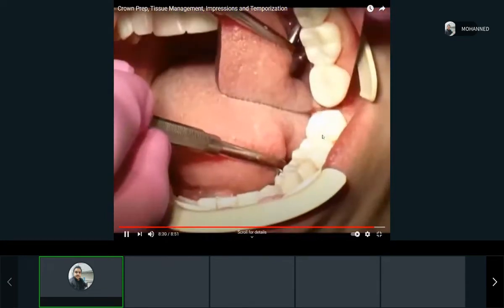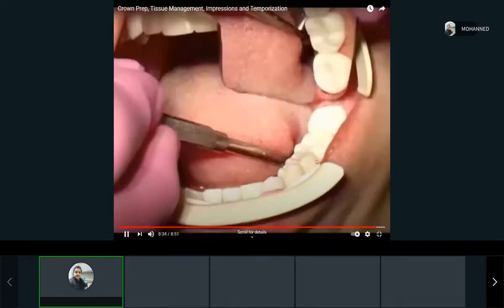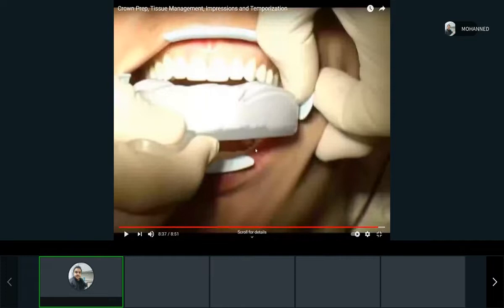It's not worth it to make separate ones because they'll break. It's better to have them that way. Yeah, definitely. Because it's not a bridge, it's separate crowns. That they could still floss, but if it's connected, you give it. Well, maybe they would floss on the other side, just that part.